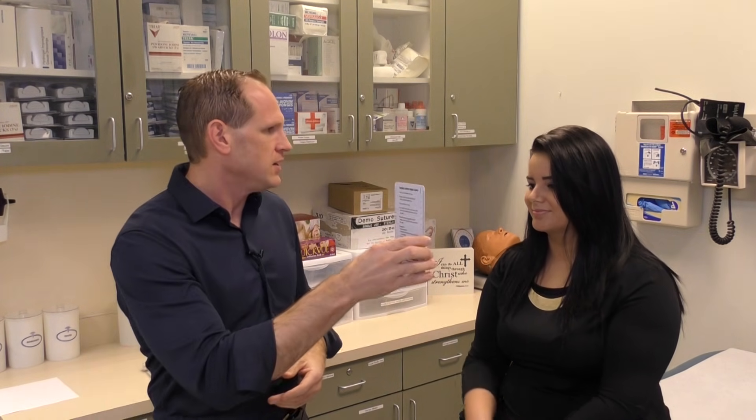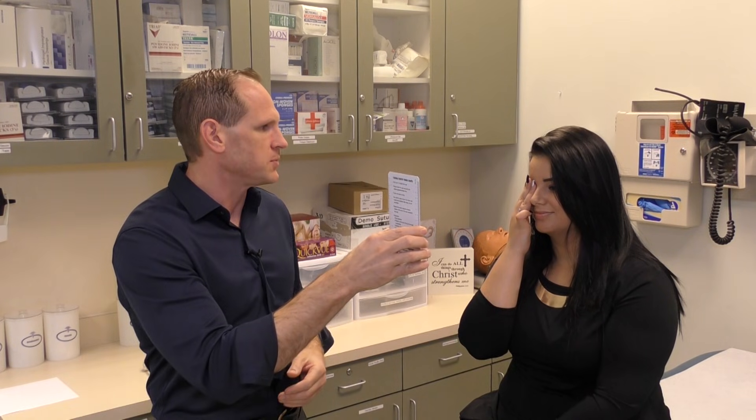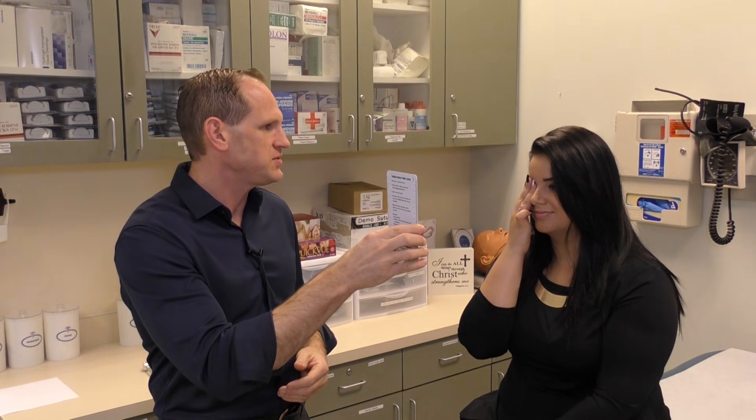Today we're going to do eyes. The very first step for eyes is to measure visual acuity. Usually we use one of these pocket charts, but we can also use a wall chart. Wall charts are better because you're not limited by a patient's presbyopia if they're an older patient. Directions say to hold 14 inches from the person's eye more or less.